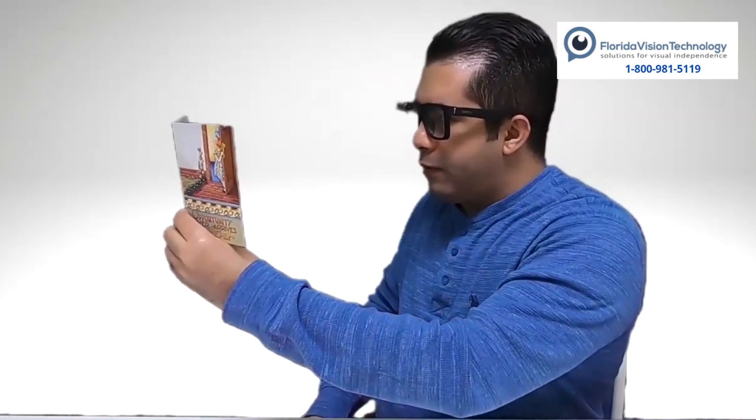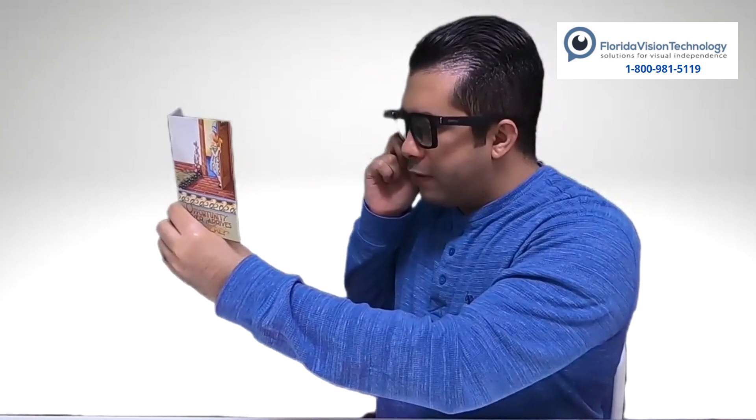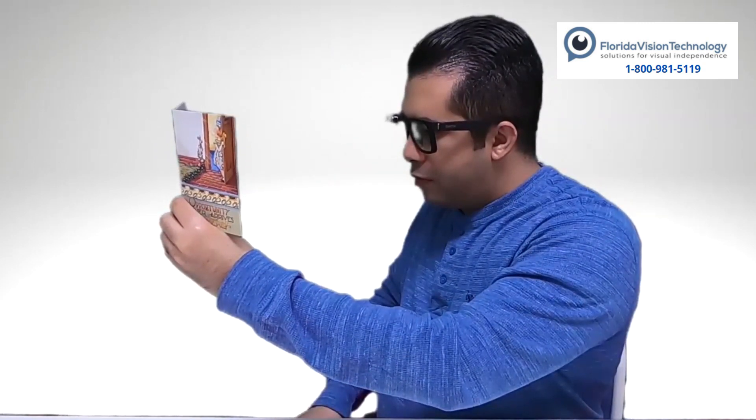The Envision Glasses also gives me the ability, as a blind person, to read handwritten documents. Here I have a card — I'm going to open it up and hold it about 12 inches in front of me, look in the direction of the document, and double tap on Scan Text. You heard the beep twice, the camera shutter — now it's processing. Reader: 'Cindy, congratulations on your new job. I know you will be an amazing teacher. Love, Mom.'